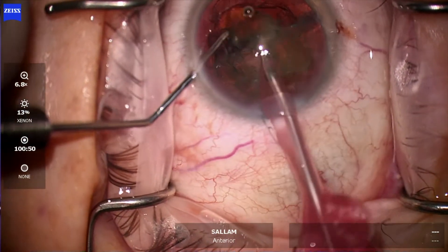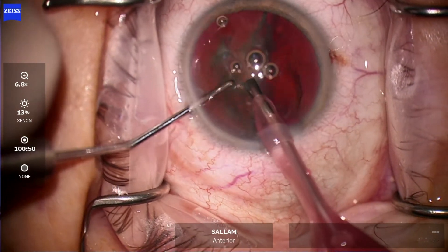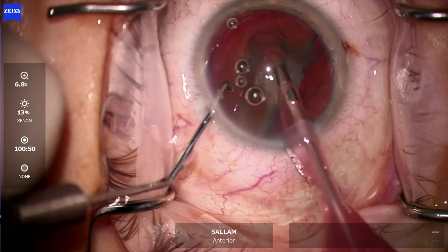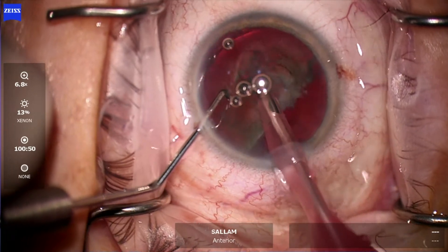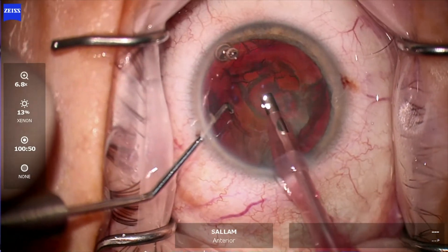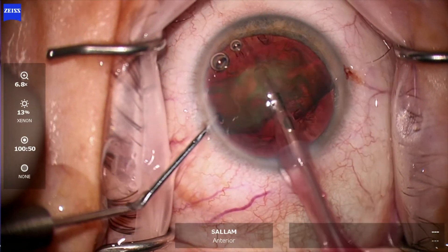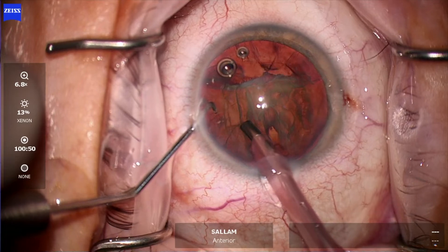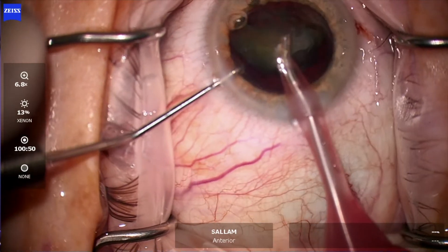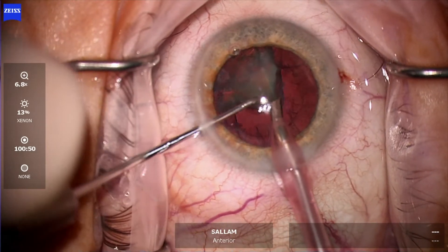Now there's a small part of the nucleus, so just taking it out. Rotation and working on the other hemi-nucleus. For some reason I cannot grasp it and I'm consuming it — I don't want this to happen. Trying to get a good grasp, rotating again, got a good grasp, but it's tumbling and I'm consuming it. You want to grasp it, get it away from the capsule, then chop it again. Just trying to grasp in a bulky area — successful now. I like to get it to stand up and chop what comes up.